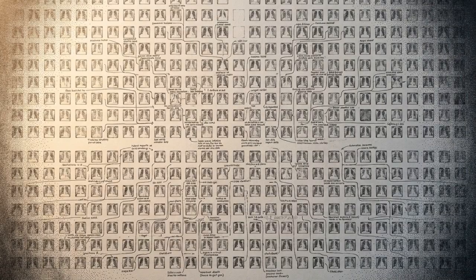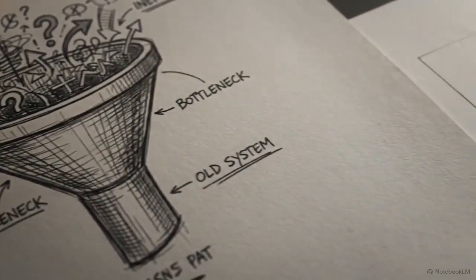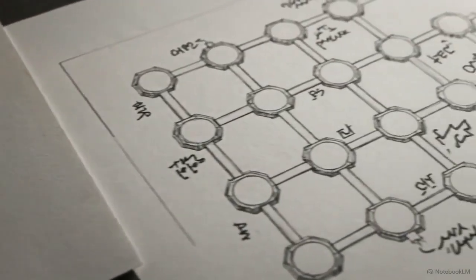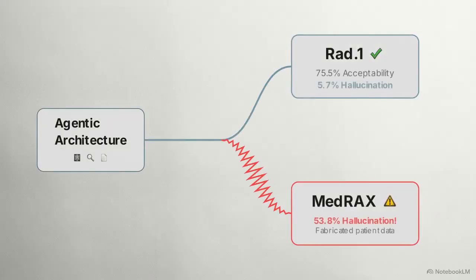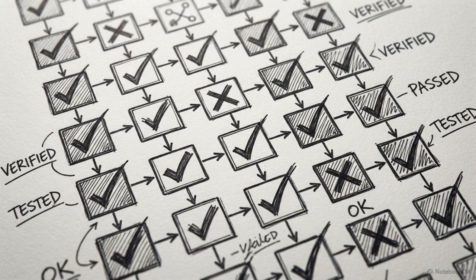Evaluating 212 consecutive patient scans clarifies the current limitations of medical AI. Single-pass generative models are currently unable to provide reliable zero-shot radiograph interpretations. Coordinating specialized subtools through agentic workflows is the necessary framework for medical analysis. The performance gap between Rad.1 and MedRAX indicates that the agentic approach requires precise, validated execution to be safe. Rigorous, task-specific benchmarking of every individual component is required before these systems can be integrated into clinical environments.